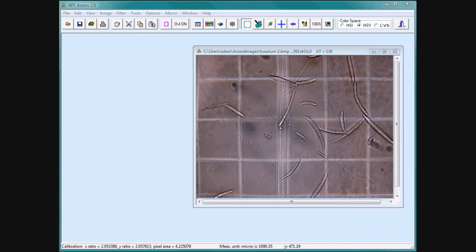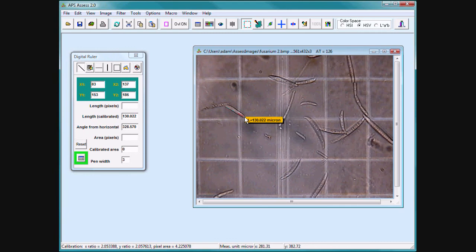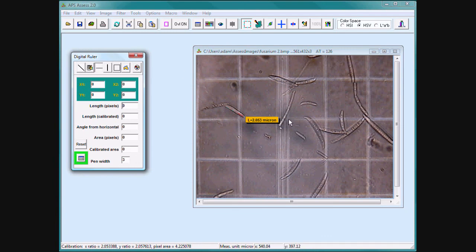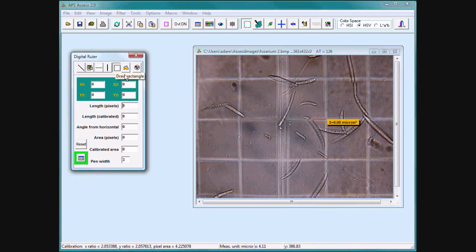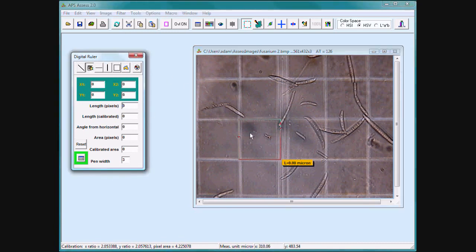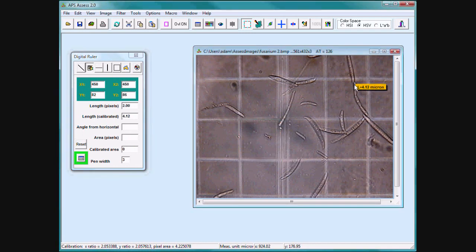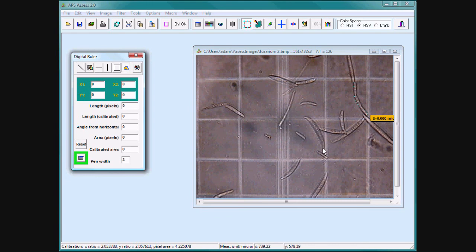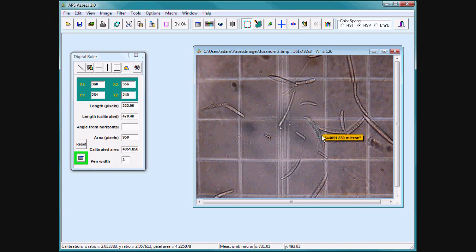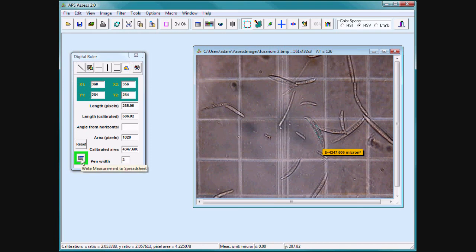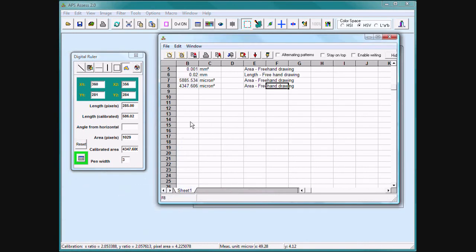Once Assess is calibrated, the tools can easily measure distance or area. Open the digital ruler. Trace a line or an area, freehand drawing or freehand closed curve. Clicking on the spreadsheet icon copies the information into the spreadsheet.